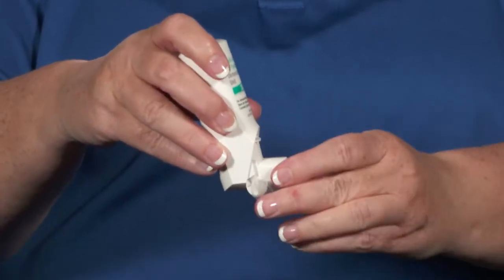When it's time to take your medicine, hold the Respiclick with the white part pointing up. Open the cap wide open until you hear a click like this. Never ever shake it because the powder will spill out. Now it's ready to use.